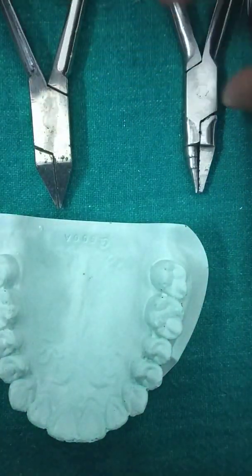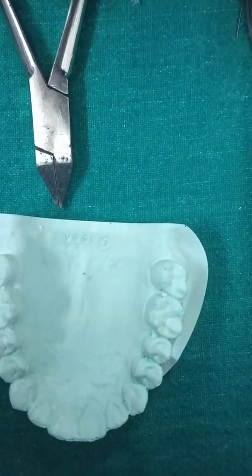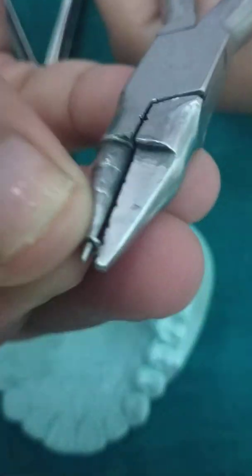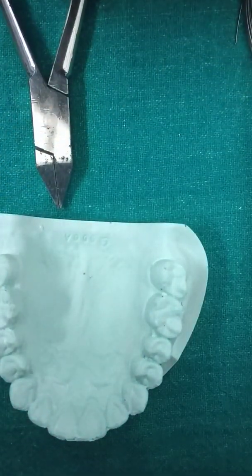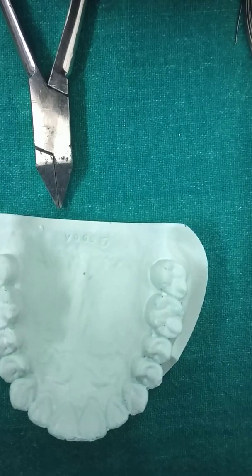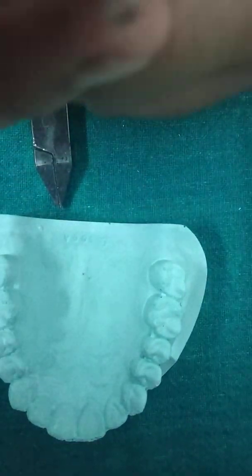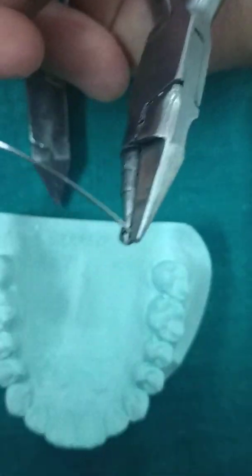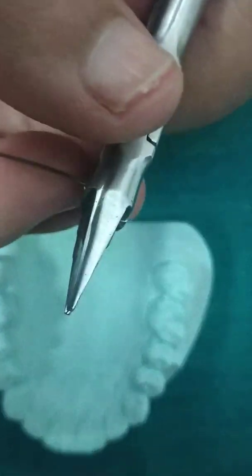First, how do we fabricate it? With the help of a universal plier, we have to make a small pin head, just like how we make a tag. I have moved it around the tip of the universal plier, and then I am going to make an ninety-degree bend.